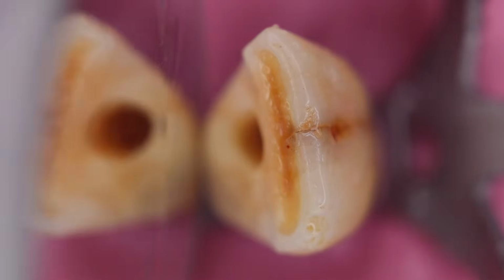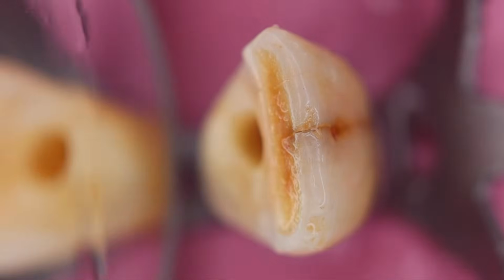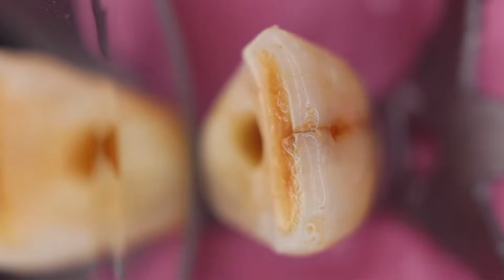So you can see that we are able to form the triangular shape of the access cavity. We can still further modify it.